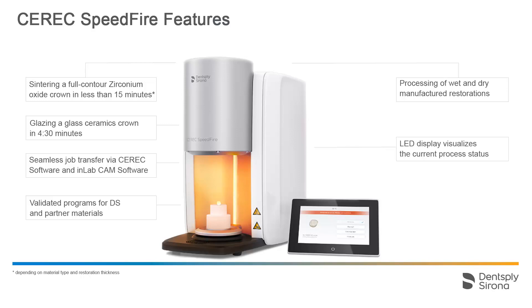CEREC Speedfire supports processing of both wet and dry manufactured restorations. The LED bar indicates the current processing status, and the touch display offers intuitive operation.